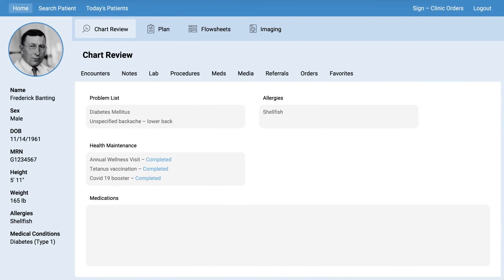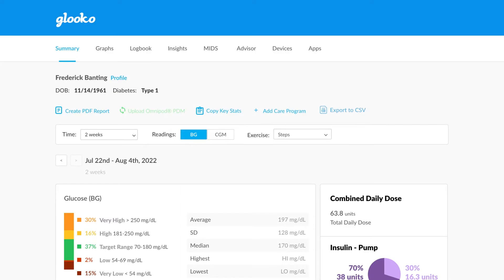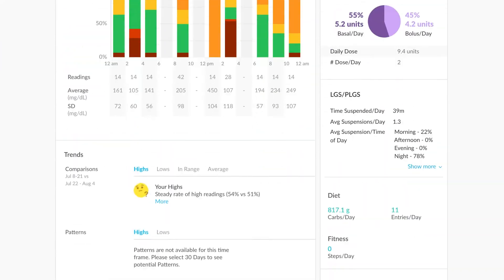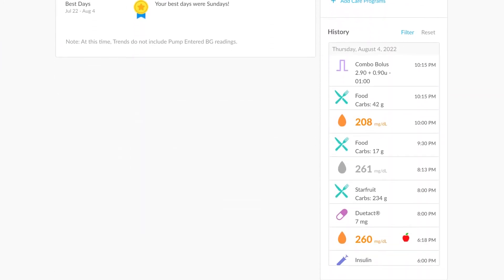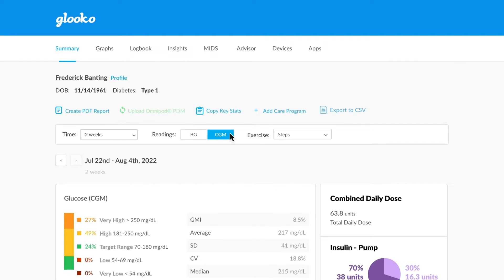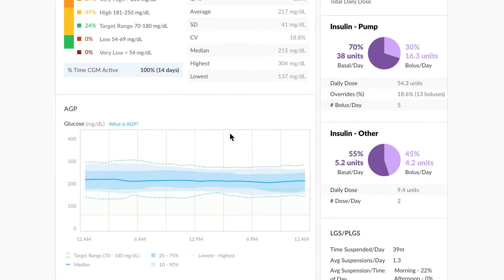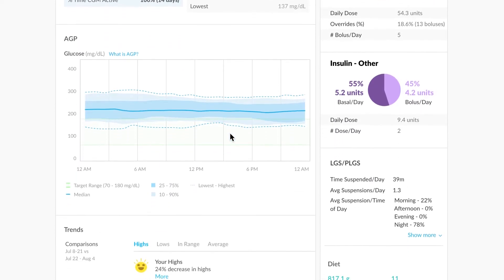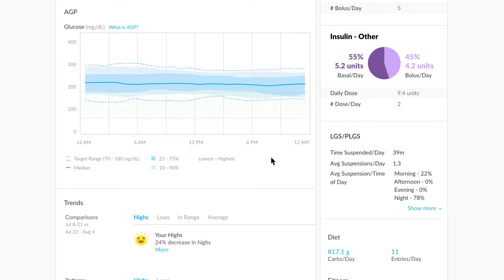Glucose one-click integration supports a direct link from a patient's medical record within your EHR to the same patient's profile within the Glucose web application. This integration eliminates the need to remember login credentials and search through Glucose records, so all your patient's synced device data and key diabetes management statistics are made accessible with only one click of your mouse.